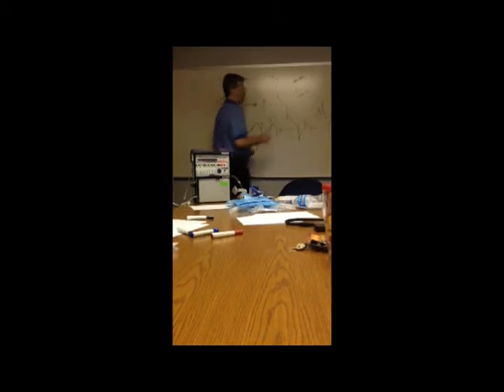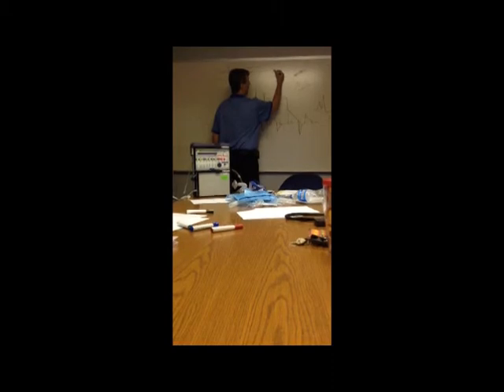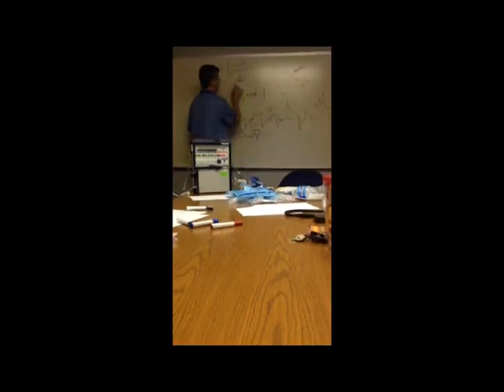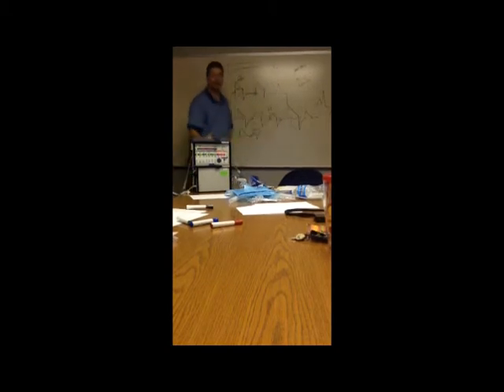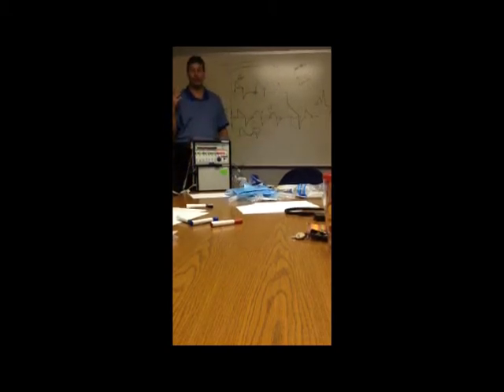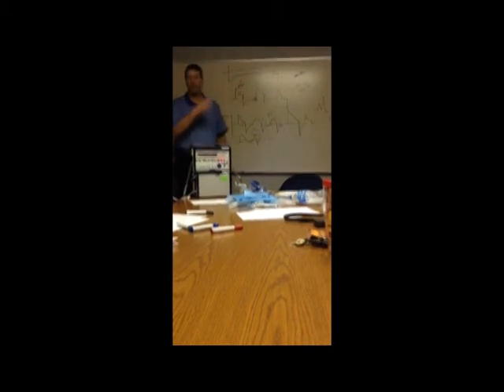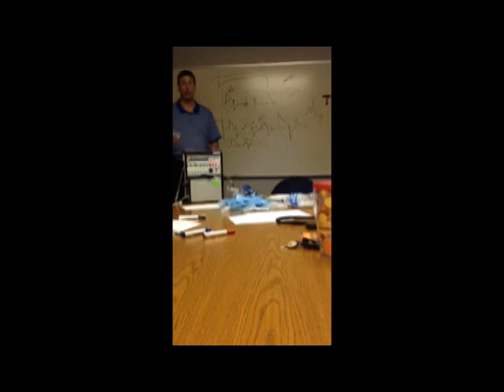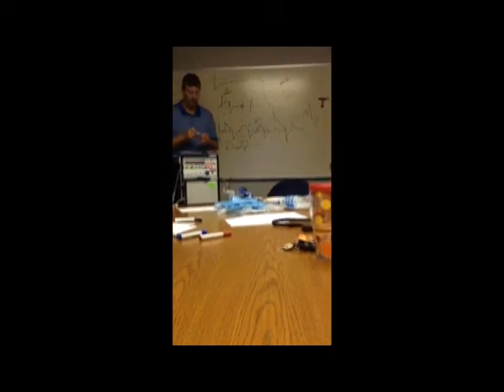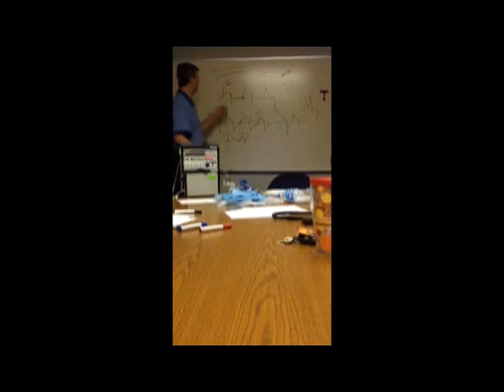What that looks like on a waveform for us would be that breath did that, okay? And what that means is it started giving them the breath, it started decelerating the flow like it does, but they were sucking in to the point they tried to increase that flow again. So as it's tapering off the flow, 60, 50, 40, 30, at some point it's dropped below what they're sucking in. So at that point, they're working hard.